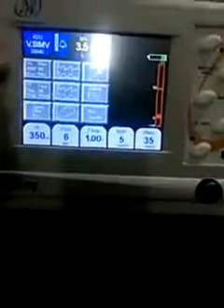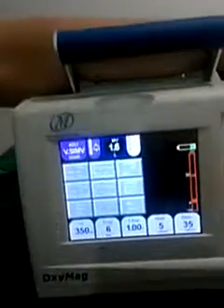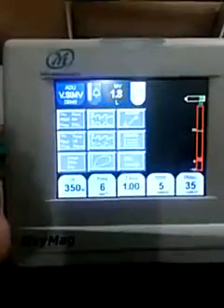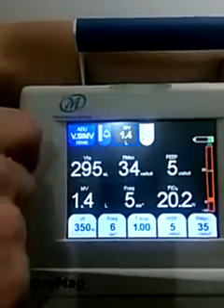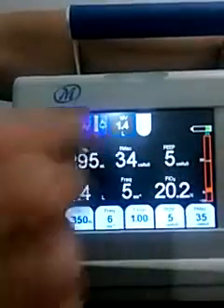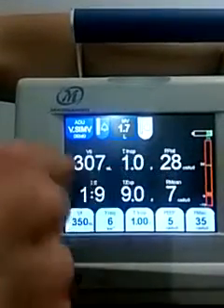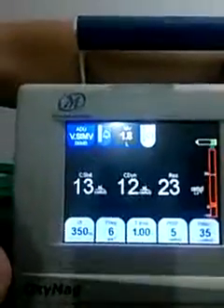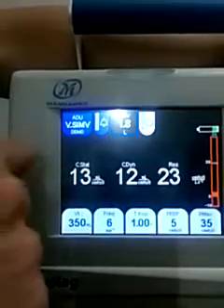When we touch the screen, we can check all parameters, monitoring parameters, and waveforms with graphs. For example, the first three windows are all monitor parameters. If we choose the first one, we can check tidal volume expiration, pressure maximum, PEEP, minute volume, frequency, FiO2. The second window is for tidal volume inspiration, time inspiration, pressure plateau, IE ratio, time expiration, and pressure mean. Also, the third window is for compliance. We have two compliances, static and dynamic, with resistance errors.